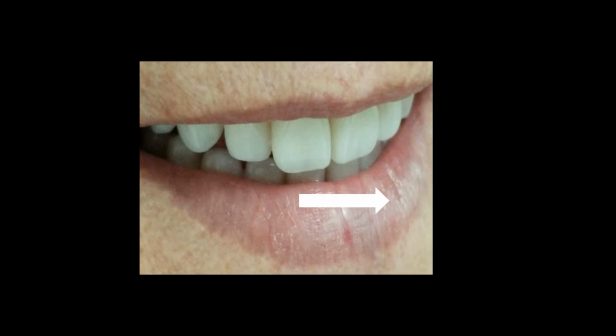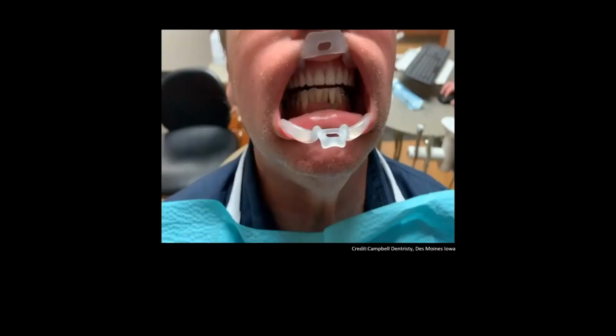Back in the day with porcelain teeth, yeah, they'd come in and go, yeah, they're clacking. Well, now with acrylic teeth, you don't really hear the clack anymore. So now that's what was happening. The clacking means that they're hitting. They're hitting because it's not the same as how we set it up on the articulator in the lab, as how it's functioning here. So I'm using now the building blocks of language and phonetics to help me gauge what the chew cycle is.